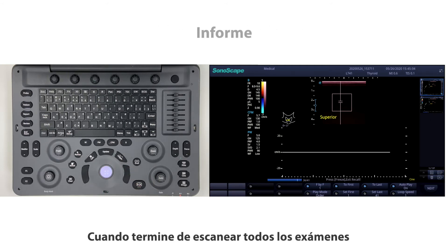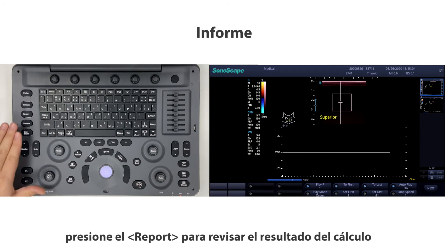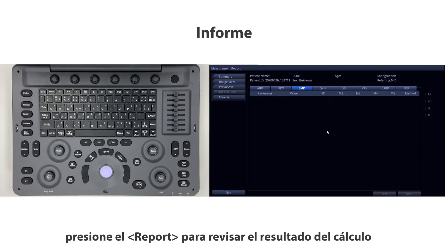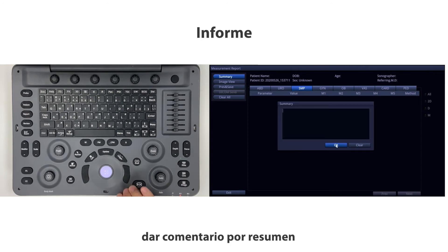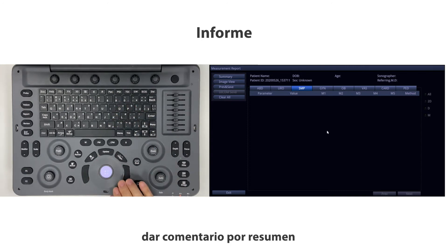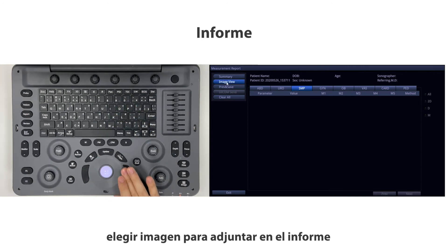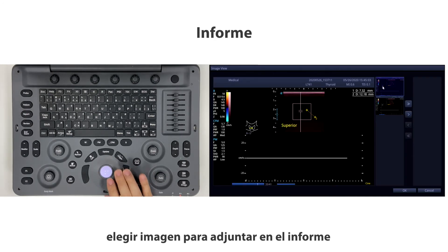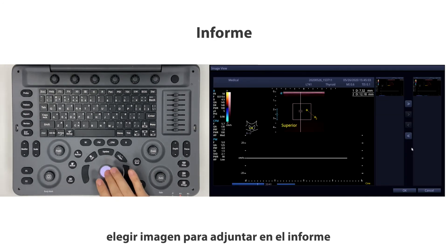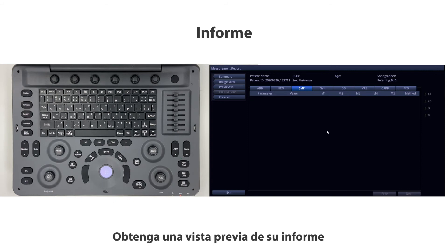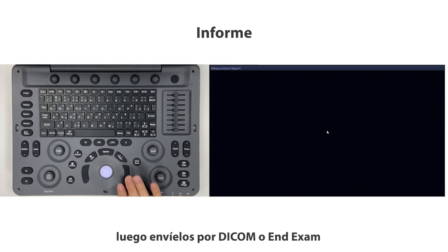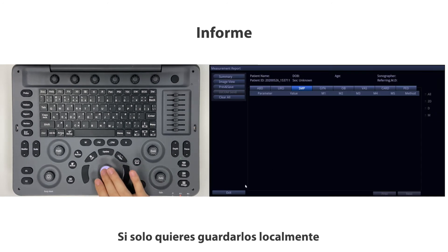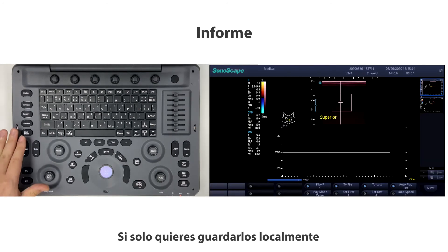When you finish all exam scanning, press Report to view the calculation results. Add a comment via Summary, choose images to attach to the report, preview your report when done, then send via DICOM or end the exam if you only want to save locally.